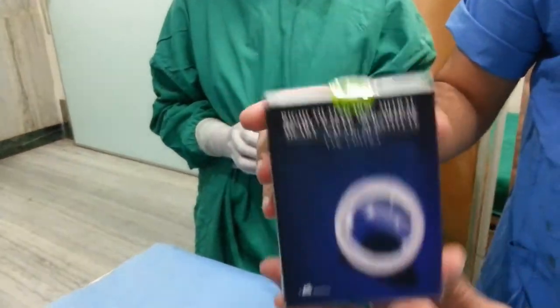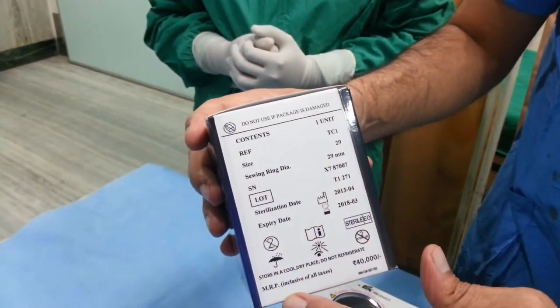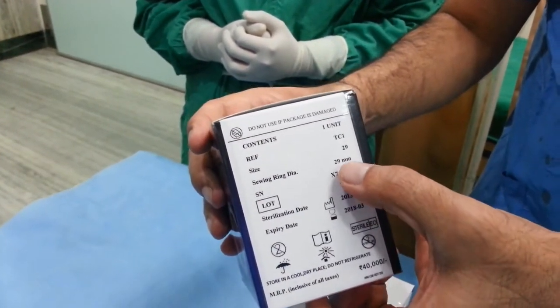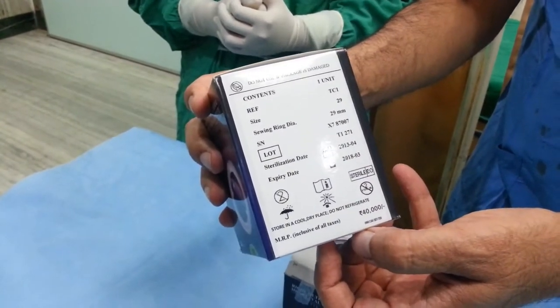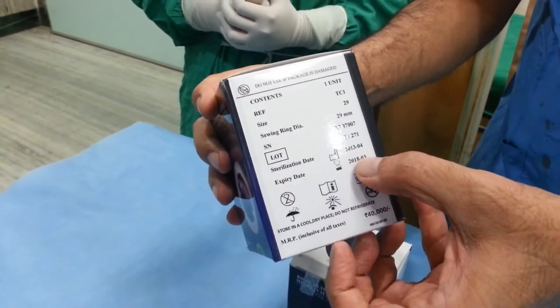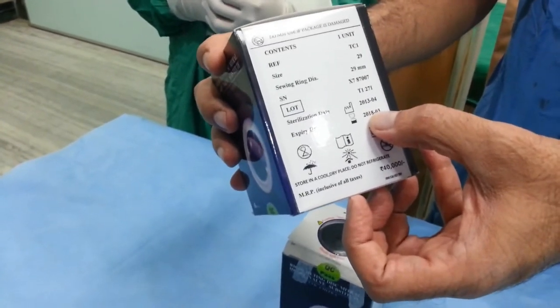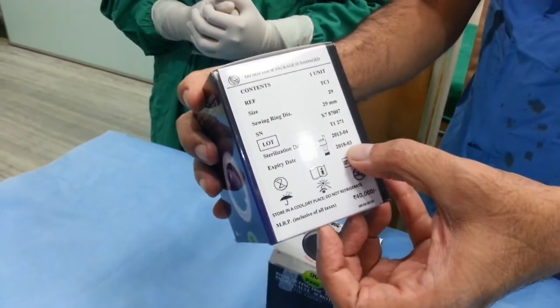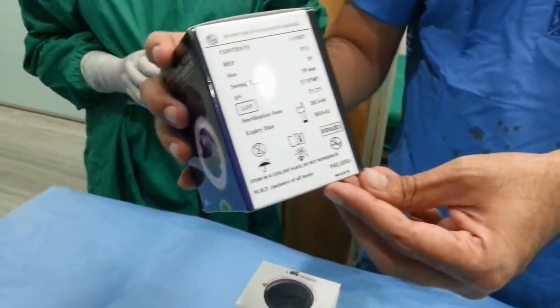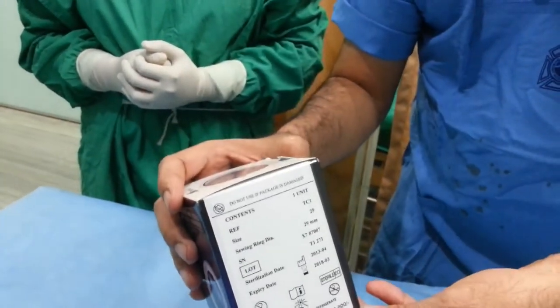The valve will come in a box like this, well packed, and it's got a sticker label here which shows that it is a 29 millimeter Chitra valve. Got it? It also shows an expiry date. Now she has to read loudly, TTK Chitra 29, expiry date 2018 March. Once she has read that out, the anesthetist, the perfusionist and the nurse say loudly, heard it, okay.